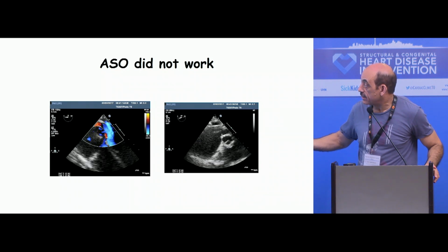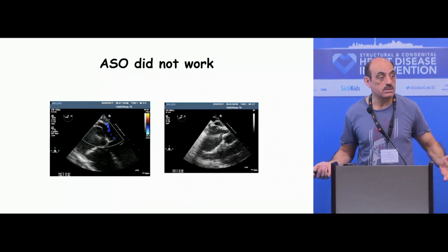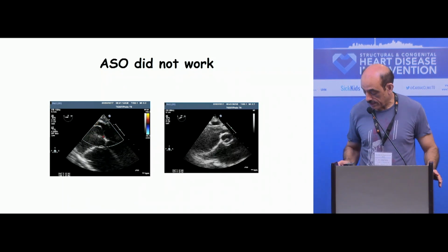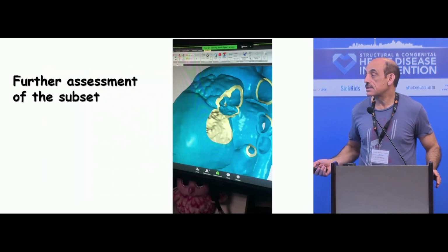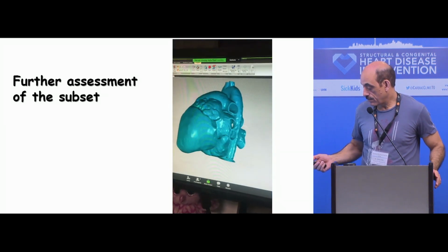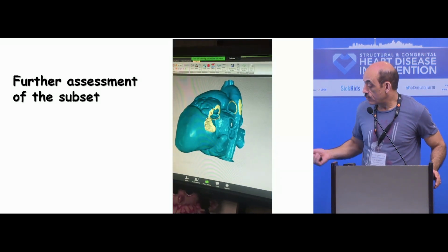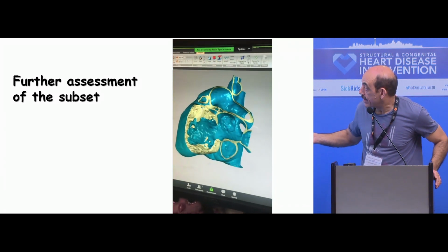Would I put the device here, or would I put the device on this septum? We tried on both sides, and it absolutely didn't want to work. So going there, all right, let's run this quick. Can you make it fast forward? So when you go from the left atrial side here, you can start appreciating your atrial septum.